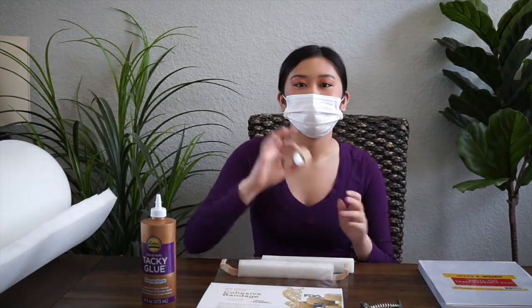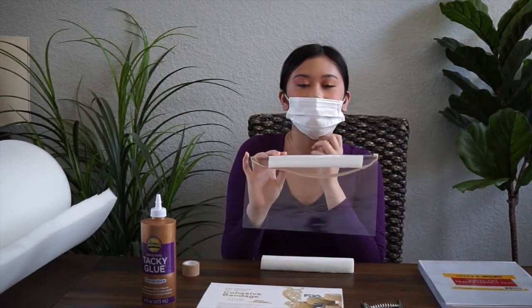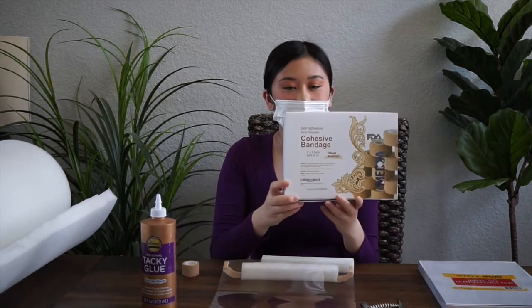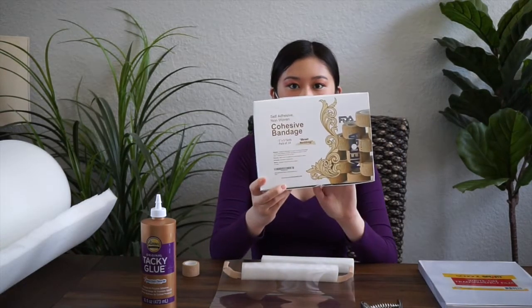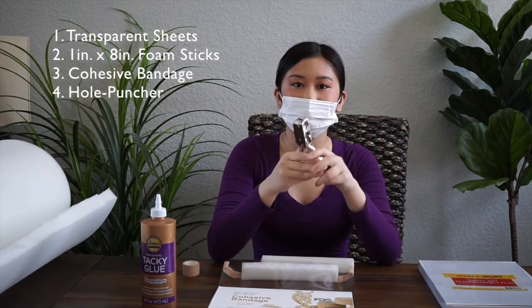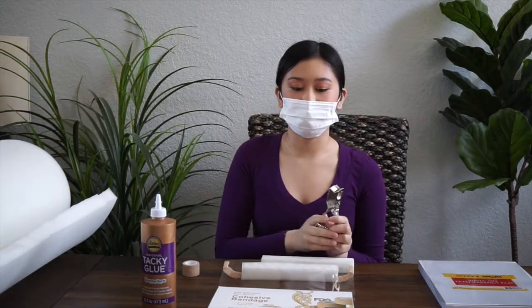So they look about like that. You're also going to need some cohesive bandage or a co-band, but if you can't find it somewhere, you can always just make it like this without the co-band, with the holes in the side, and then provide it to the hospitals because they have co-band, and so they can add that themselves and still be able to use the shields. But the one we have comes in a 24 pack, and you can get it on Amazon, which is pretty easy to find. So there's that. But like I said, you don't have to have it. And then we also used this interesting hole punch that punches rectangles, which you'll see in a sec, but you could also just use a regular hole punch if you have that at home. Just punch it enough so that the co-band will be able to fit through it.